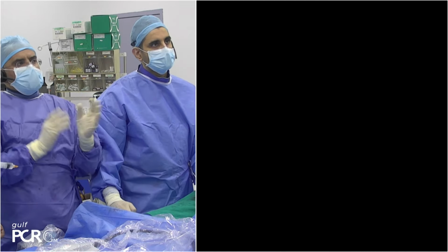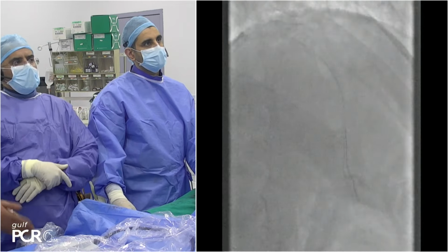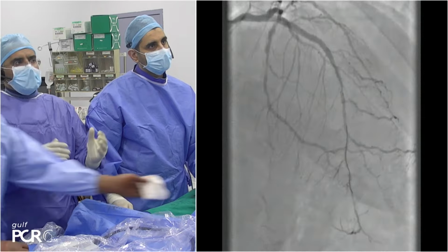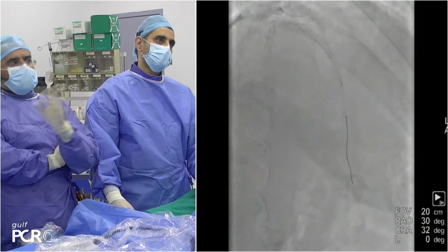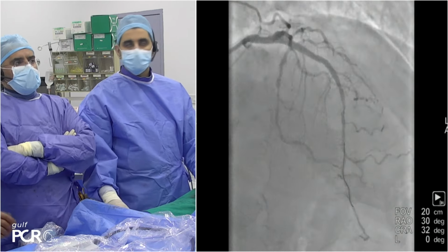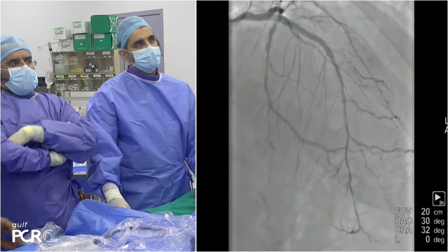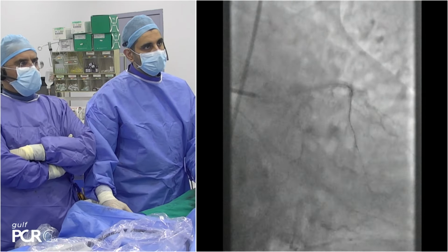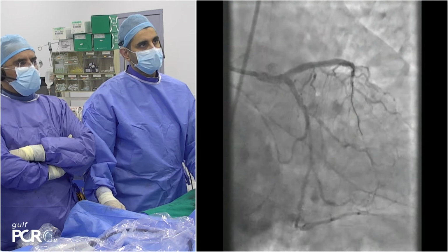I think the stent itself is well expanded, well apposed. The question is, should we do more than that segment? Should we go more distal or not? But I think the stented segment is very acceptable to us. But the question, as I told you, is should we do more into the LAD, or are we just happy with this? I think you can't do more to the LAD, although the distal part of the LAD is still going to be ischemic. I mean, this guy had angina class 2 and a positive stress test.